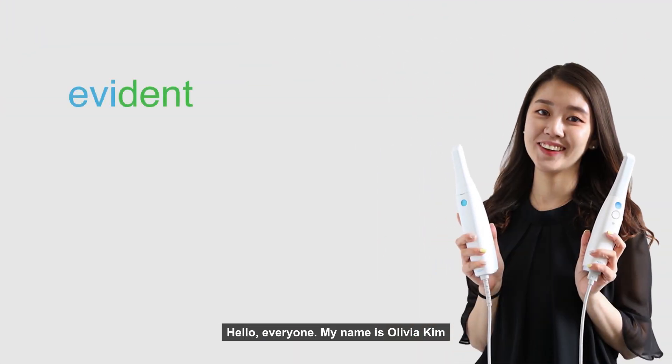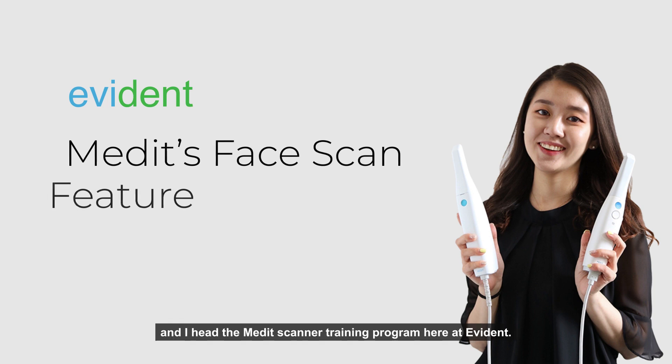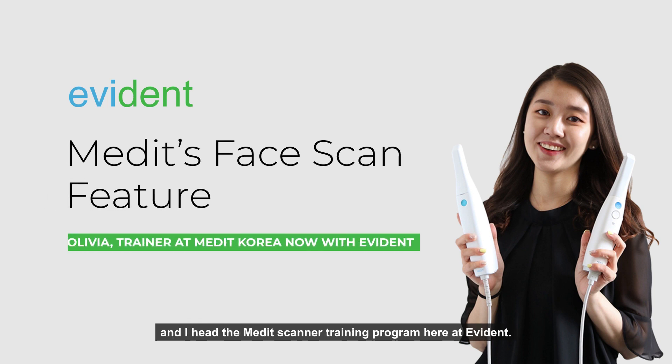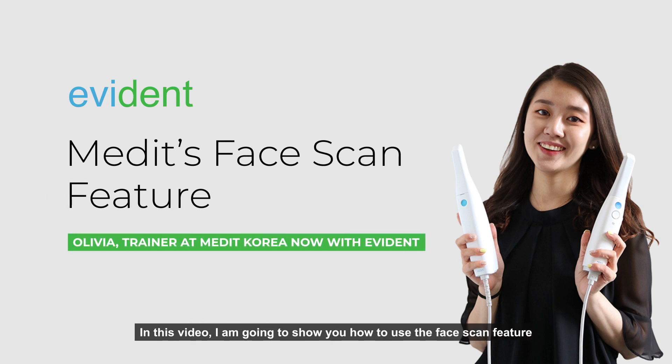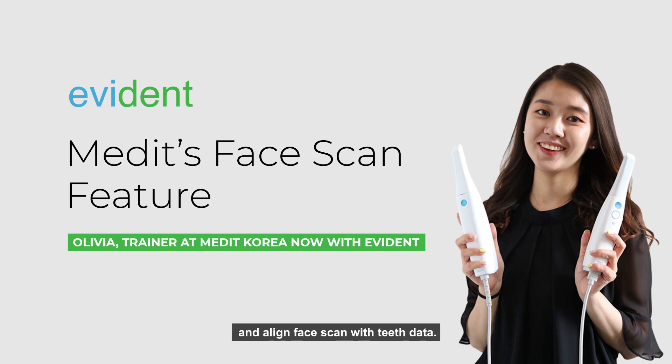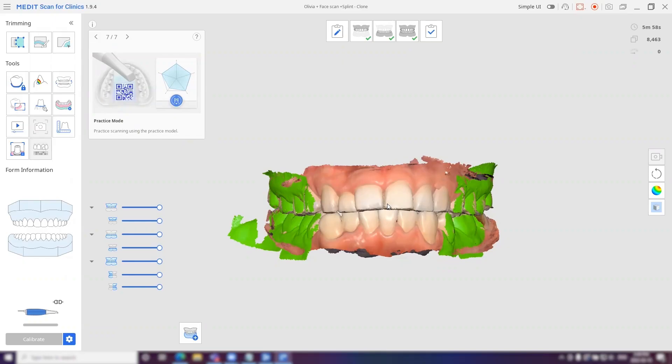Hello everyone, my name is Olivia Kim and I head the MediScanner training program here at Evident. In this video, I'm going to show you how to use the face scan features and align face scan data with the TIS data.